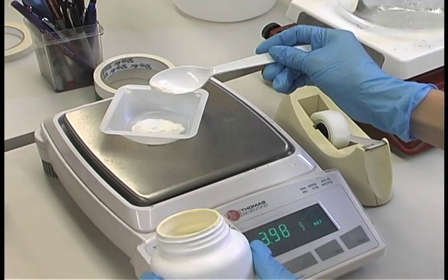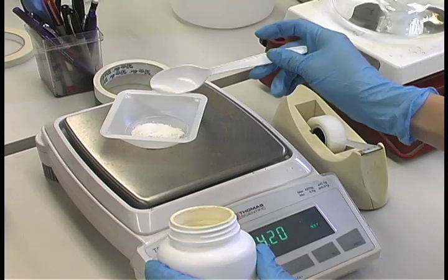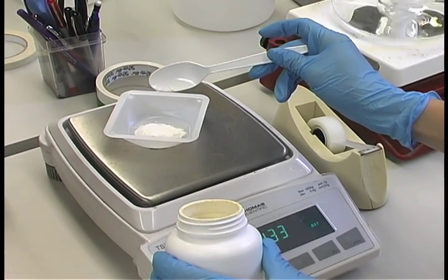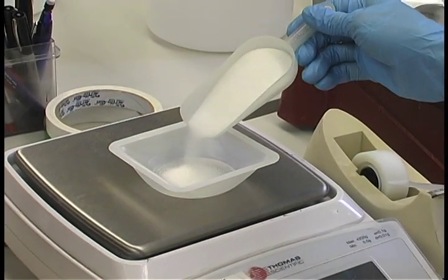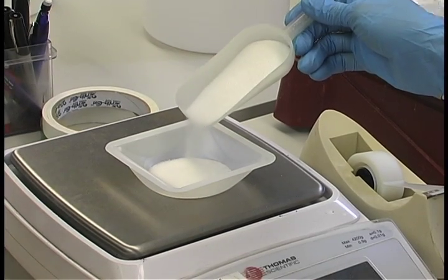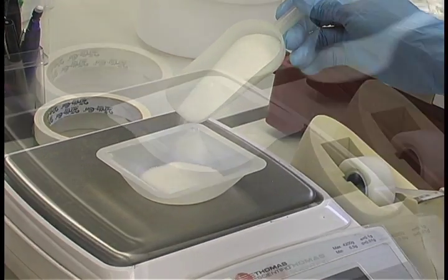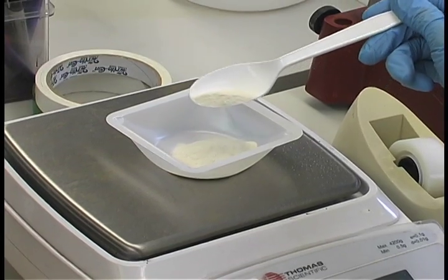Always use either a weigh boat or weighing paper when weighing out chemicals to protect your balance. Repeat the procedure with all other dry chemical items that are going to be included in the medium. This includes carbohydrates, gelling agents, or other components.